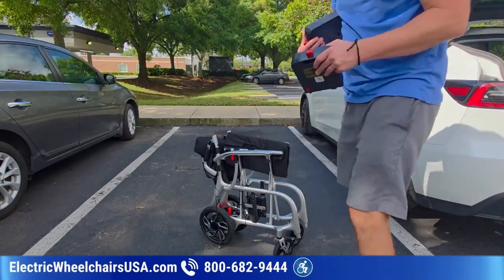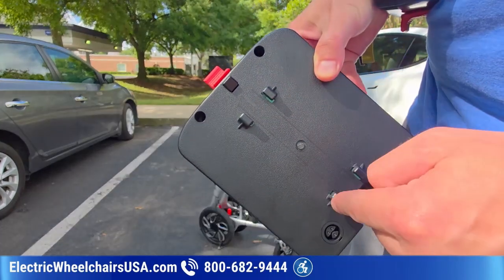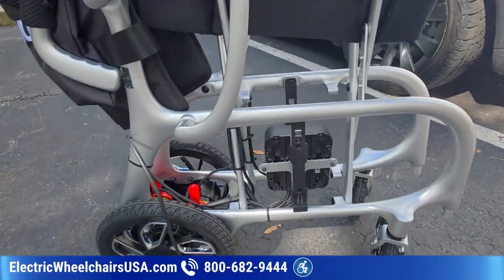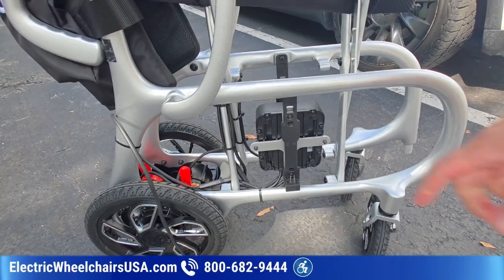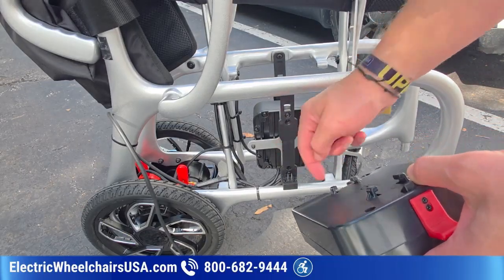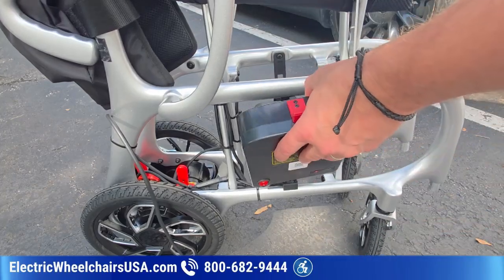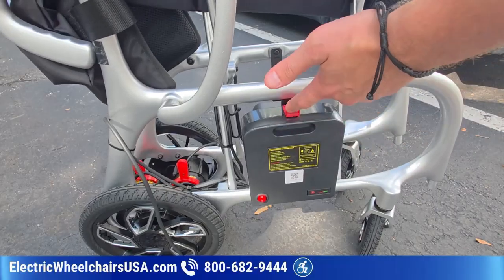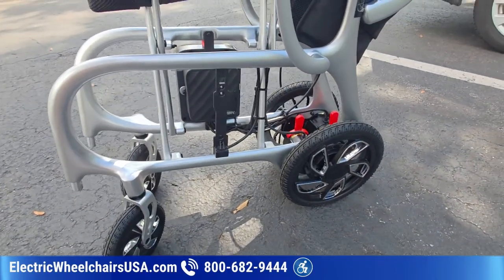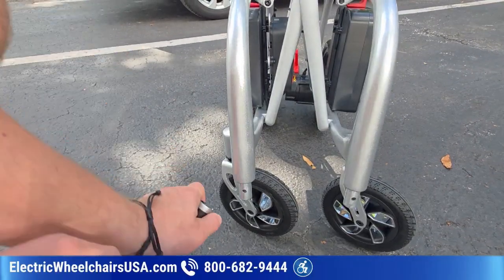And as far as putting them on, I'll just show you. There's 4 little pieces that come out, and you slide them onto this bar on the side, and you can see there's little teeth here which line up with the teeth here. So I want to put these in between each of these little clips on this side around this piece that's a little larger on the clip, and then you heard it snap into place. That's really how easy it is to put the batteries on. So I'll do it on this side. Put these foot plates back on.